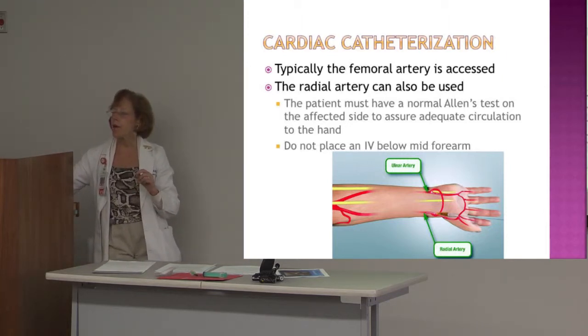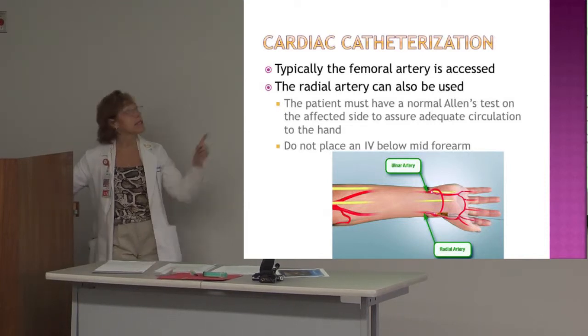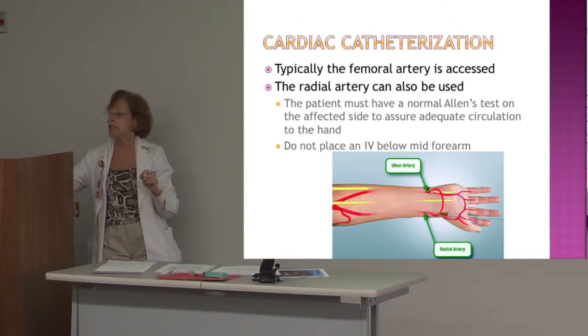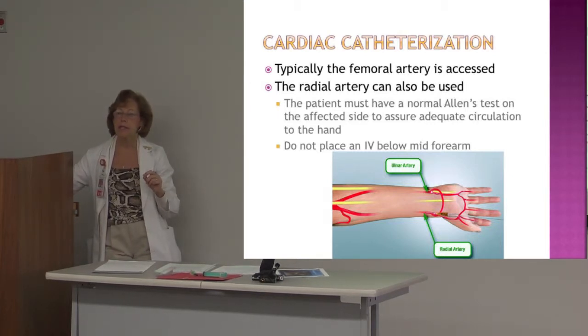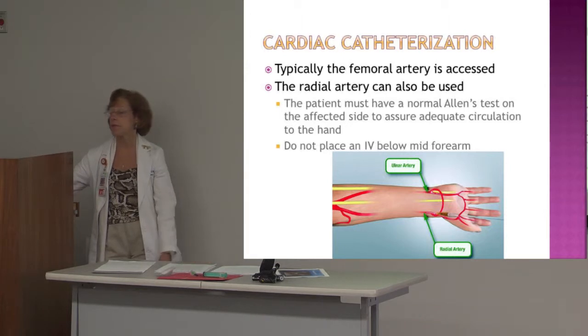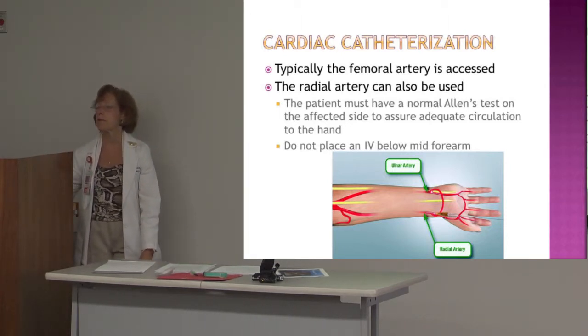Now, as opposed to 2 years ago, this actually has flip-flopped. It's more likely that you're going to get a patient that has had the procedure via radial artery versus the femoral artery, because now the docs are a lot more comfortable with that procedure, and it has a lot less complications, and the patient can get up and get around. So it really is great for the patient, and since there's less side effects and complications, it's really good for recovery. So we're going to see more of the radial artery now versus the femoral artery.